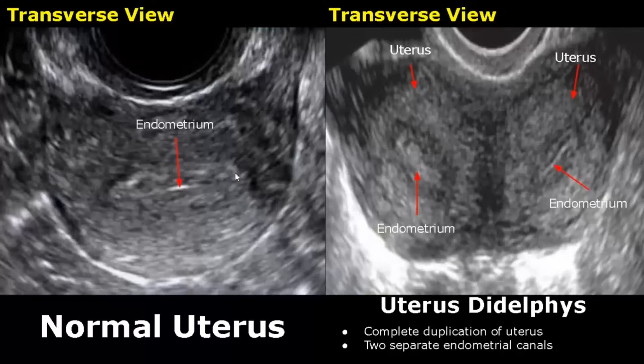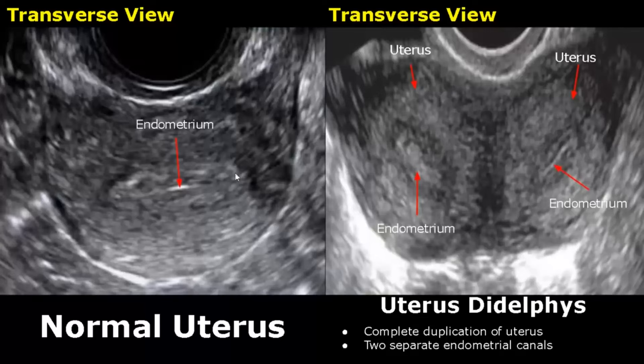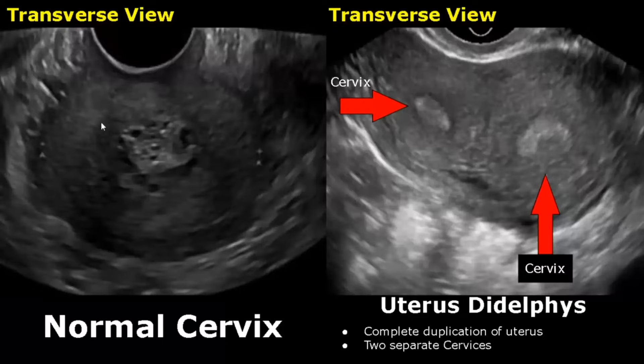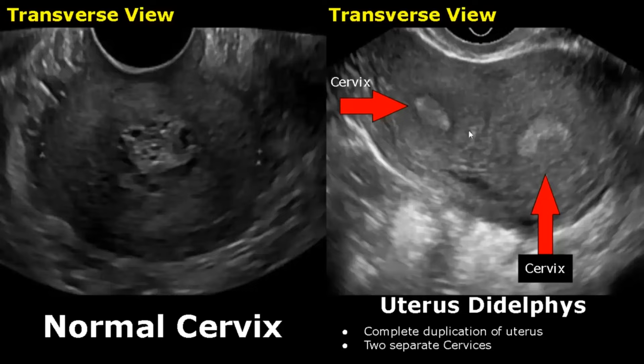Here we have transvaginal images in transverse plane showing the normal uterus versus uterus didelphys — we can see two separate uteri and two separate endometrial canals. These are transverse images of the cervix taken transvaginally showing the normal cervix and two separate cervices in uterus didelphys, because there is complete duplication of the uterus.